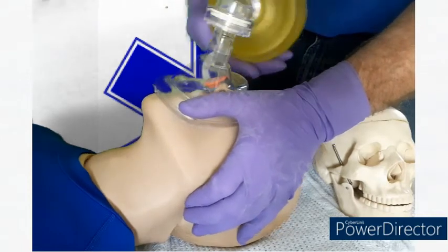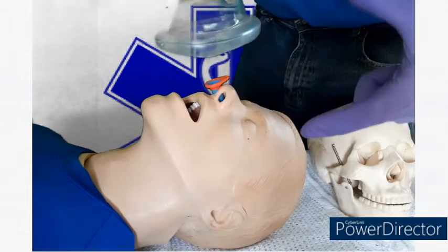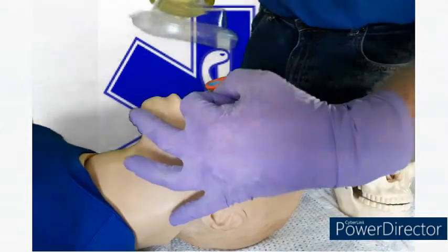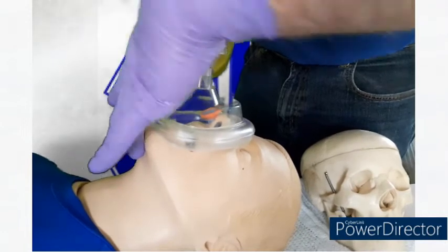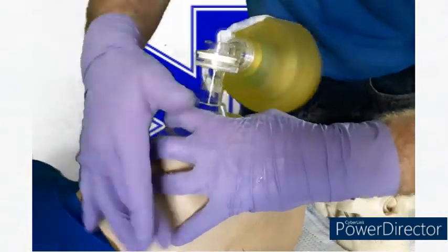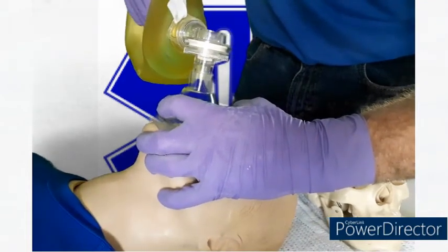If you are on your own, you can do the solo technique, which would be the anaesthetist grip, which would be a C, which holds the mask in place, and an E, which pulls the jaw up. The most important thing is your middle finger is in the middle of the chin. So get your C on the mask, middle finger in the middle of the chin, other fingers around the jaw, pull the jaw up into the mask, and then you can ventilate.